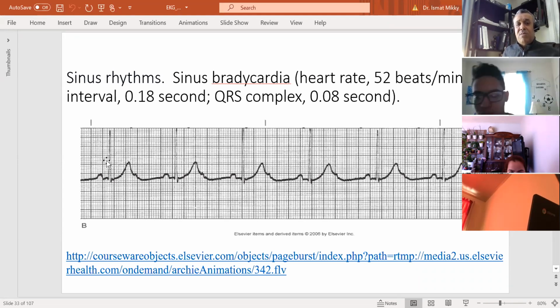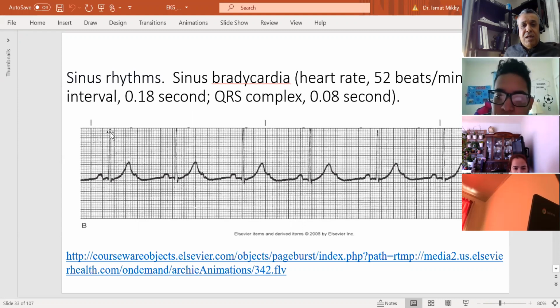So then we'll have a normal sinus rhythm. To identify any dysrhythmia, you will find out from the calculation of the heart rate. So our pre-marked dots for the 6-second strip fall in here, and then another one here. So we have 15 and 15, 30 boxes. So this is our 6-second strip, and we'll start counting the cycles.